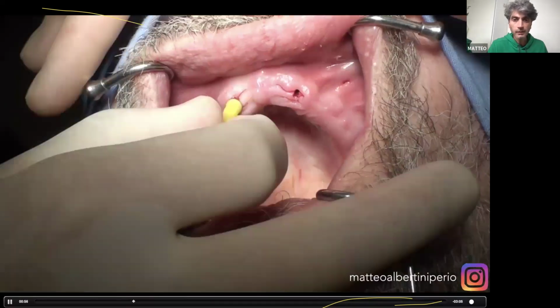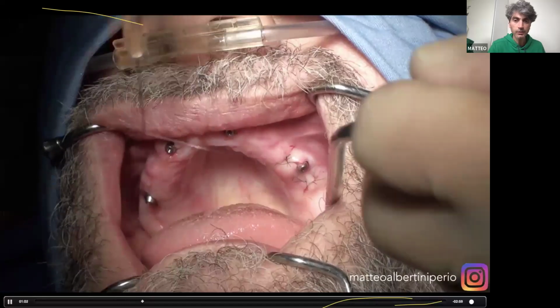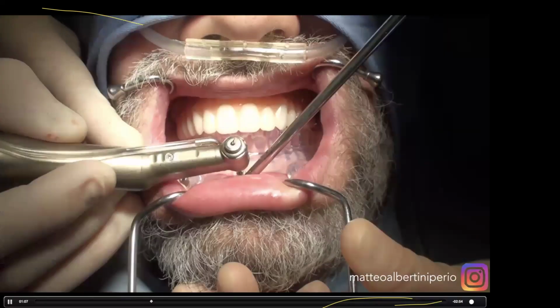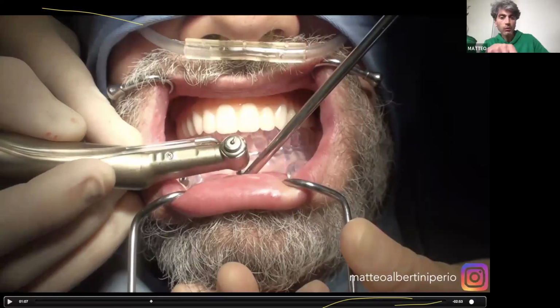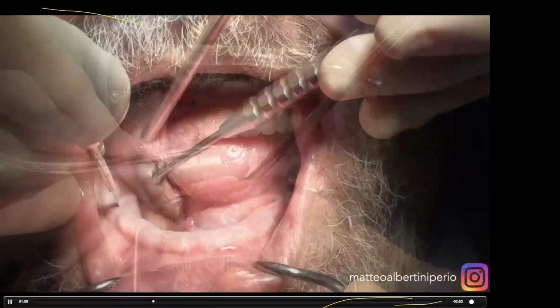Okay, so in this case, we're placing the abutments, two straight and two tilted abutments. Далее мы устанавливаем специальные мультиюнит абатменты для того, чтобы выровнять ангуляцию имплантатов. And now we are operating the mandible, just drilling the beds for the anchor pins. Здесь мы ставим специальный шаблон для того, чтобы создать отверстие для анкорпинов. Уже работаем на нижней челюсти.